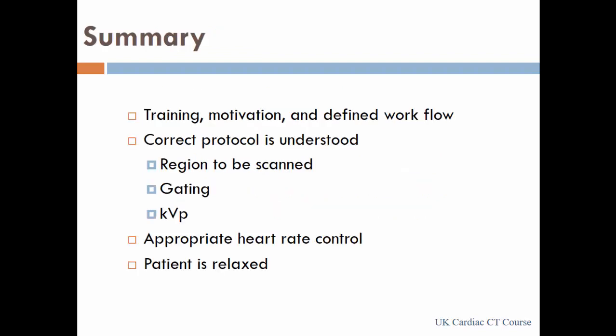Okay, so in summary, the most important thing is that all the staff are motivated and properly trained. There's a well-defined workflow, how you are moving from one step to another. The protocols should be correctly understood. Again, remember that you are doing the scans to obtain diagnostic information, so your image quality should be optimal for it. At the same time, you have to use protocols to minimize the radiation dose. Appropriate heart rate control is a must for both purposes, very, very important. And this can only be achieved if your patients are relaxed when they come and when the scan is being done. So very important.